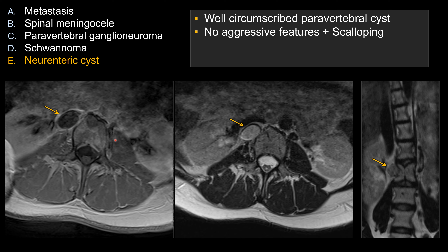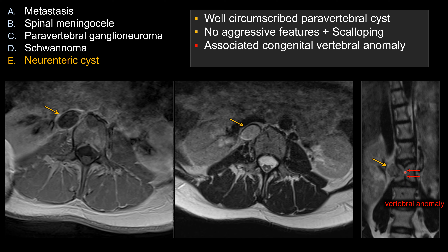This speaks to the slow-growing, non-aggressive feature of neuroenteric cysts. But probably the most important clue here is that there's an adjacent vertebral body anomaly. You can see this vertical midline cleft gives you this butterfly vertebra. So with a combination of a benign-appearing cystic lesion with adjacent vertebral body anomaly, this is a classic feature for neuroenteric cysts.